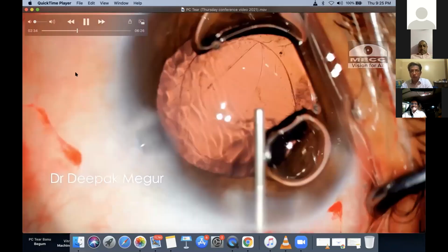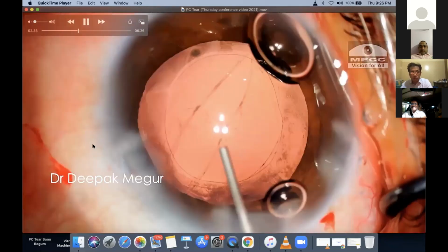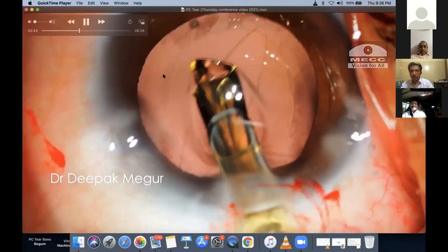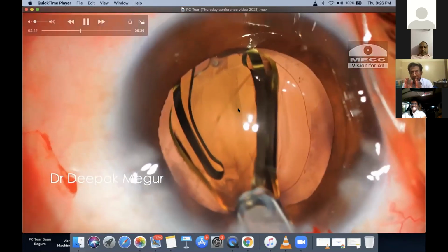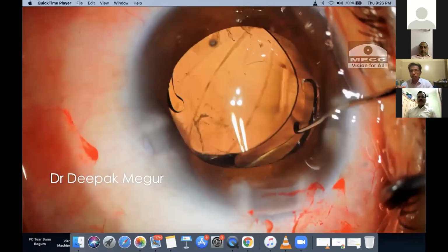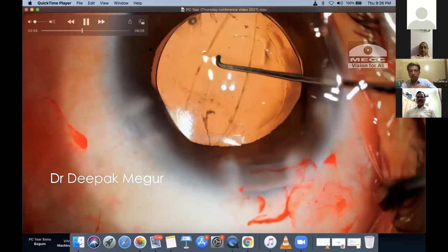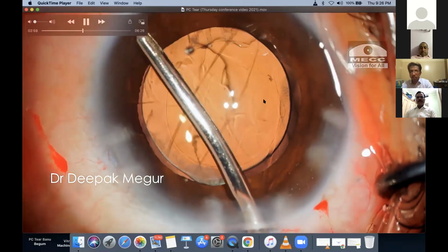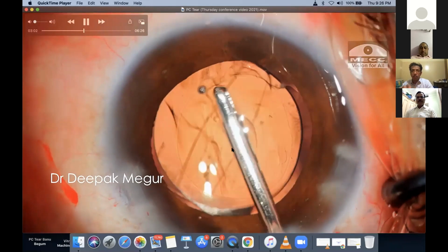And now I'm trying to form the chamber. I'm using first dispersive OVD, and then I'm also using cohesive OVD to deepen the bag here. Again, I'm always keeping a look at the shape of this posterior capsular tear. It is linear and it's not spread wide open. And the hydrophobic single piece lens is opened very gently. I ensure that the haptic opens in this area, not in this area, so that I don't disturb this area. And removing the OVD behind the lens is very tricky here.